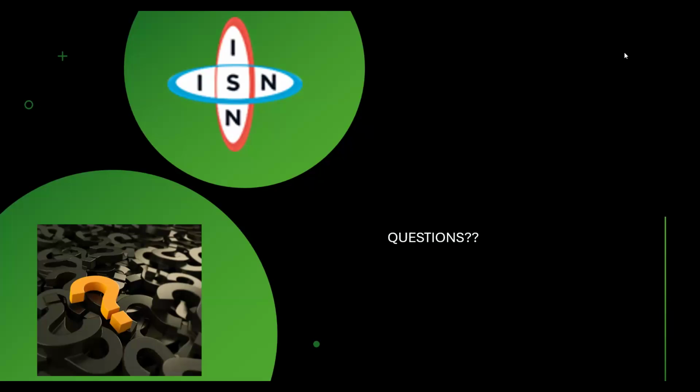Thank you. Sorry, I can't hear you, sir. Yeah, well, I'm talking on the area of the documentation. Are you hearing me? Yeah, yes, I can hear you. Does ISN have a format for their clients in the area of validation, control, and calibration for documentation purpose?